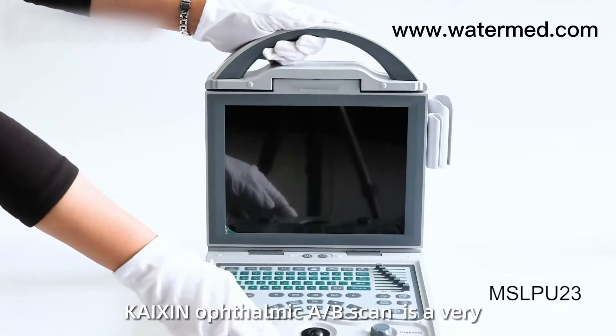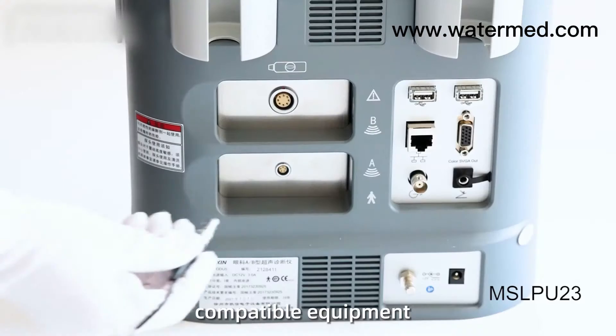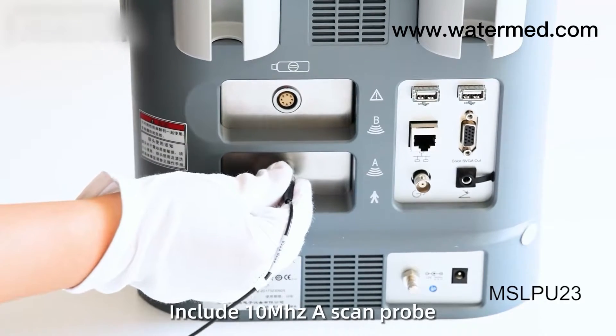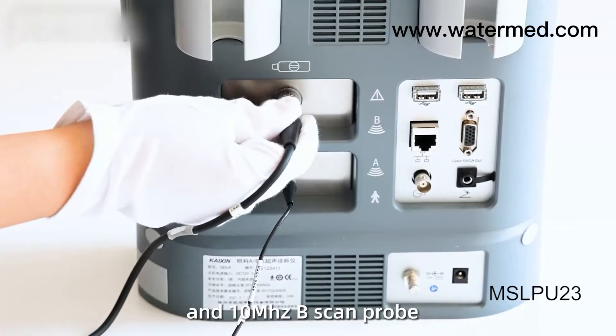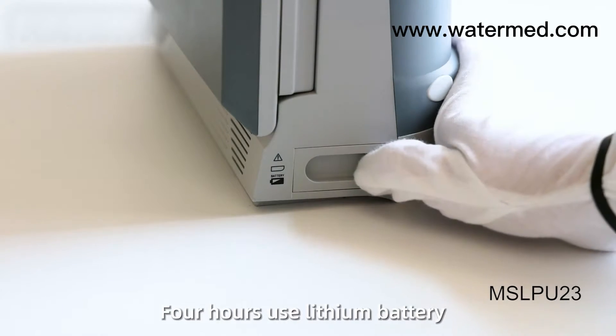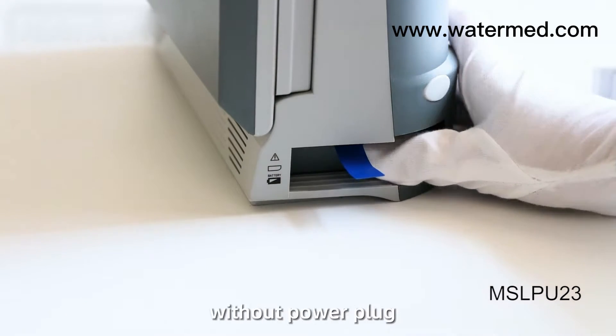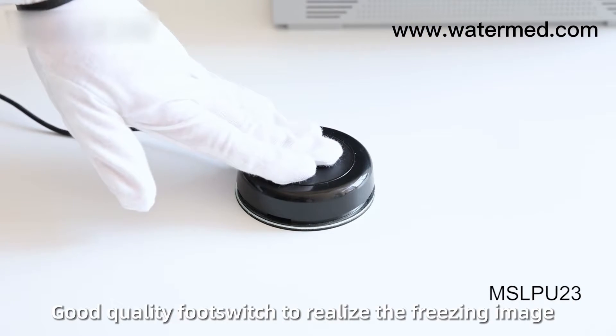UDI-U5 Kaixin Ophthalmic A-B Scan is a very compatible equipment, including a 10MHz A-Scan probe and 10MHz B-Scan probe. It features a 4-hour lithium battery, which supports the equipment working independently with a foot switch to realize image freezing.